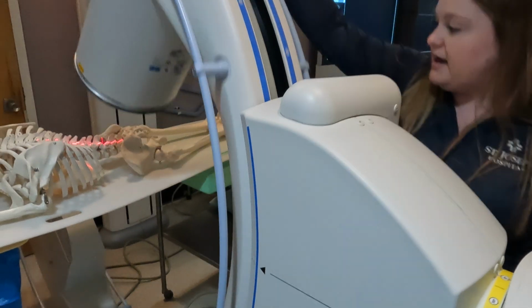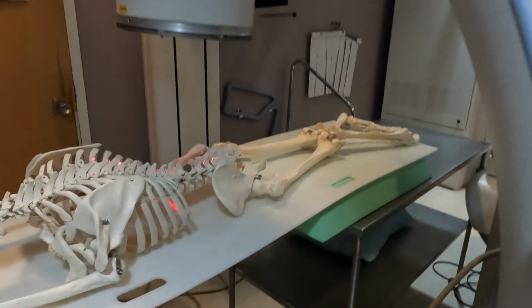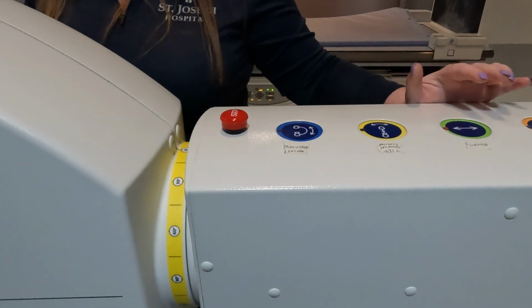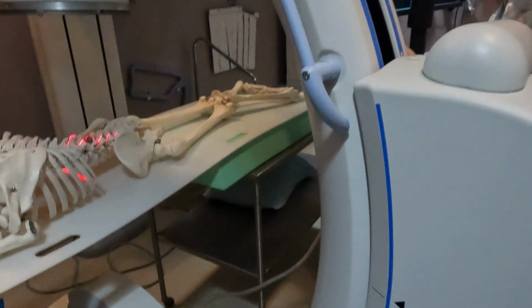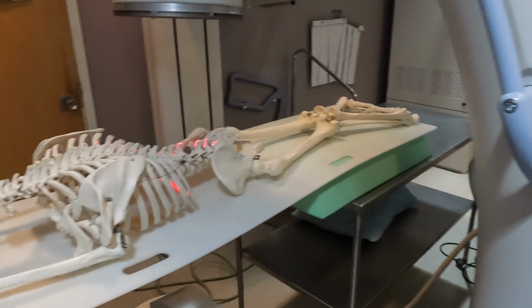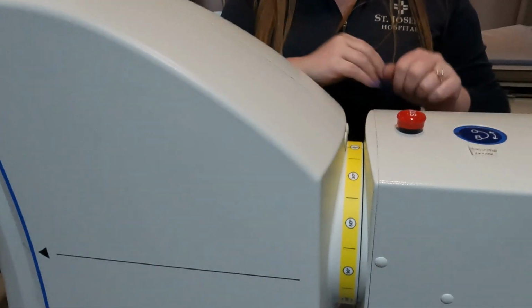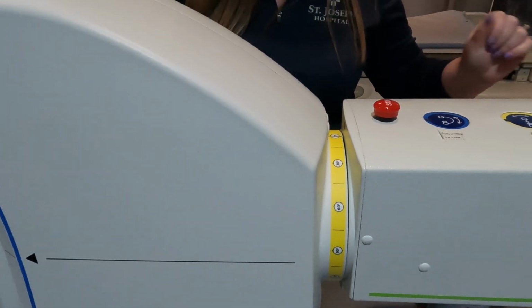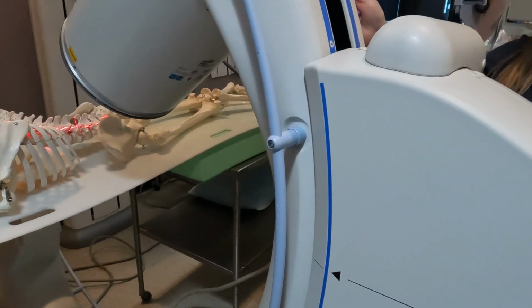So, we'll start here. I'm going to use my laser to help get it perfect. And I'm going to use this in and out just for my AP to center perfectly over the spine. Once I'm here, I can only use this button. So, now I'm going to unlock here. Spin all the way down.